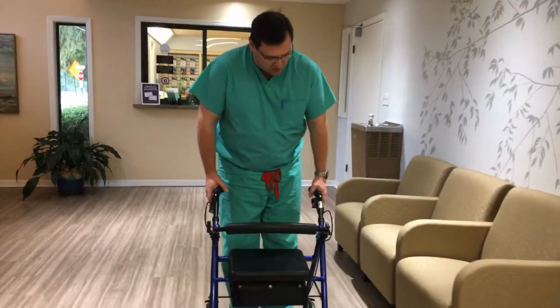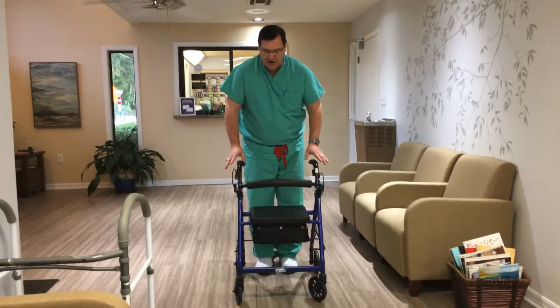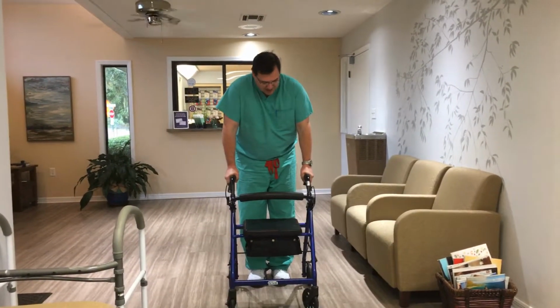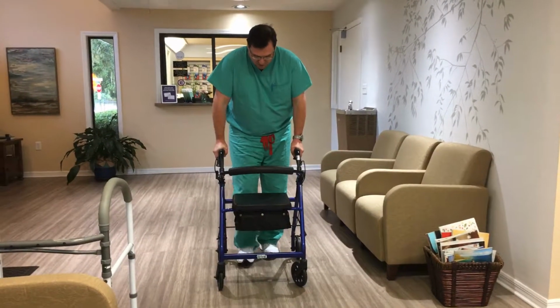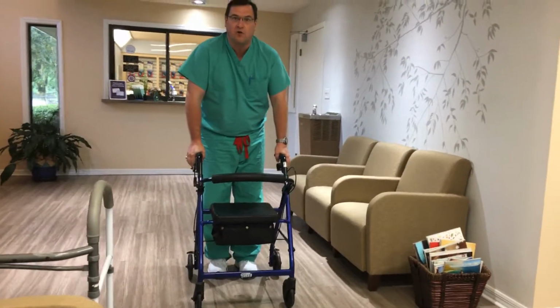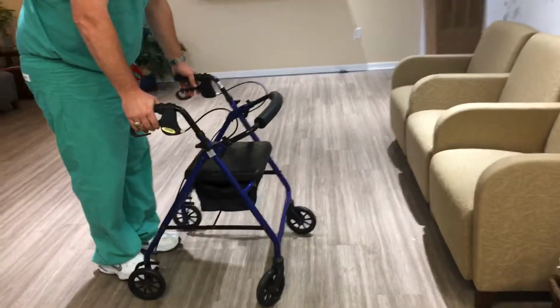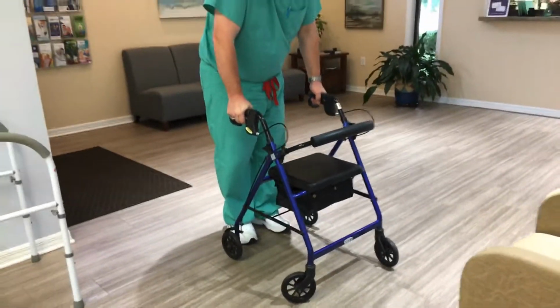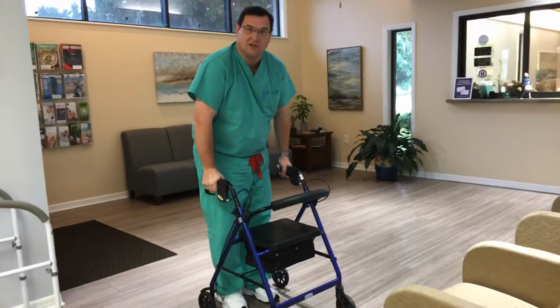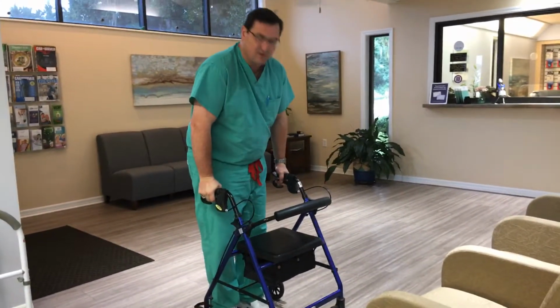But with the walker with wheels, what it requires is you bring the walker forward. This one is a little too low for my height, so you want to adjust it up. I'll talk about that in a second. And then what you would do is put your hands on the brakes, okay? Put your foot forward half a step, weight on the arms, and bring the foot up. So it takes a lot of coordination to do that, because what you have to do is slide it forward just a little bit, squeeze the brakes on the handle, bring your foot forward half a step, weight on your arms, and bring your foot up next to it. So it's slide it, hands on the brake, half a step, weight on the arms, foot comes up.